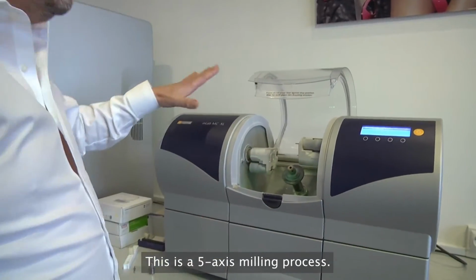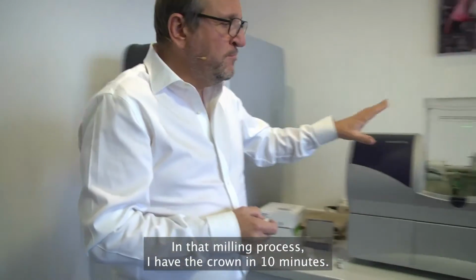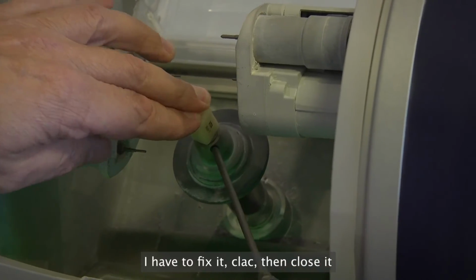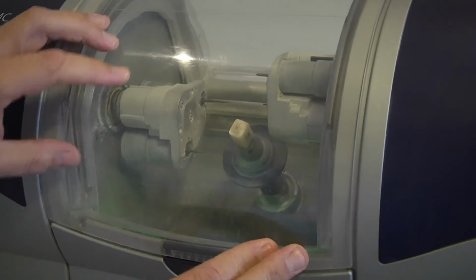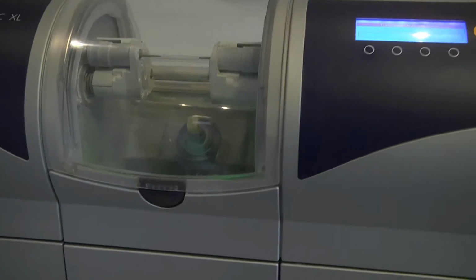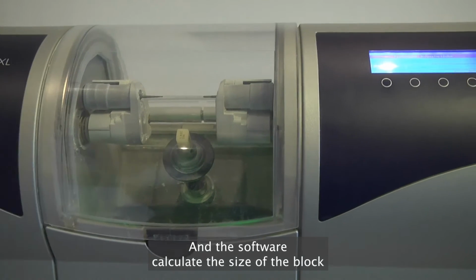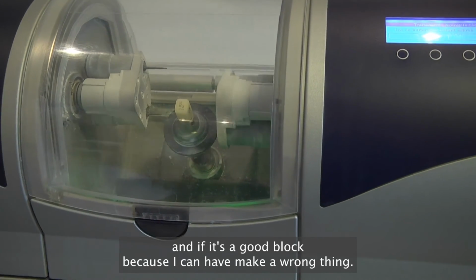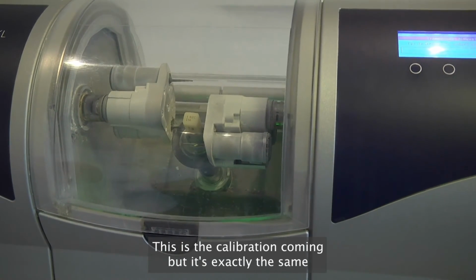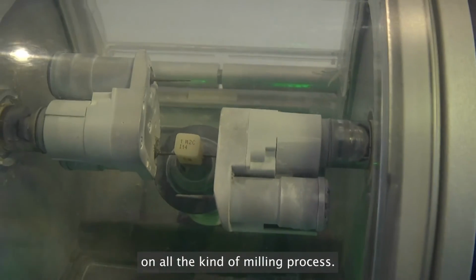This is a 5-axis milling process. In that milling process, I have the crown in 10 minutes. I have to fix it, clack, then close it, and just press start. And the software calculates the size of the block, and checks if it's a good block, because I can't make a wrong thing. This is the calibration coming. But it's exactly the same on all kinds of milling processes.